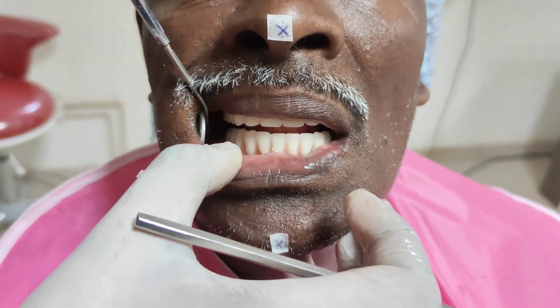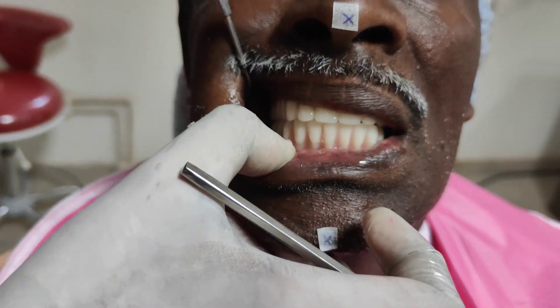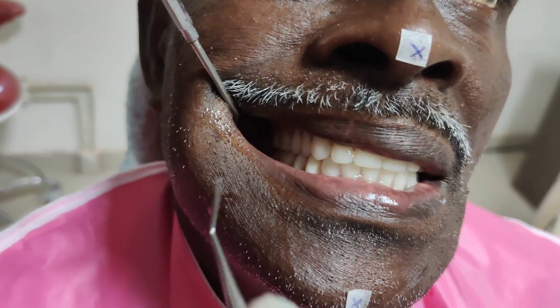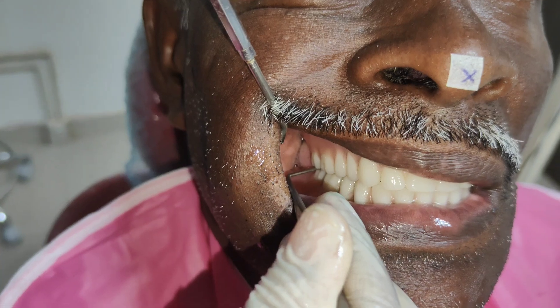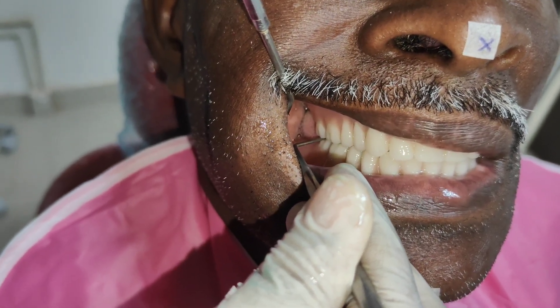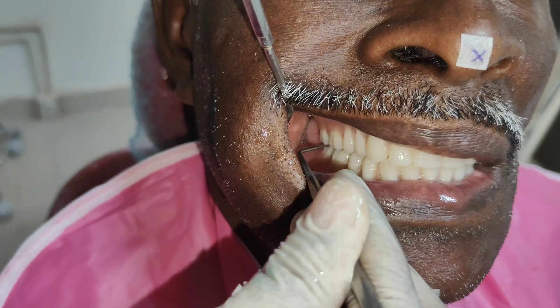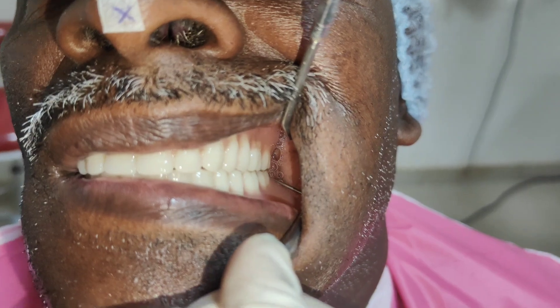After this, wedging has to be checked. The patient is asked to bite and wedging is checked by placing a straight probe in the second molar region. During wedging there should not be any displacement of the mandibular denture. Wedging is checked on both right and left sides to determine whether there is a perfect occlusion.